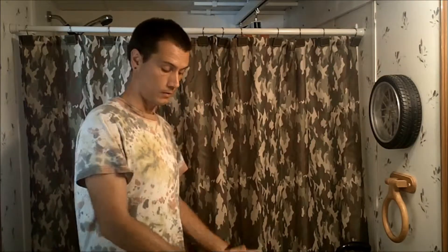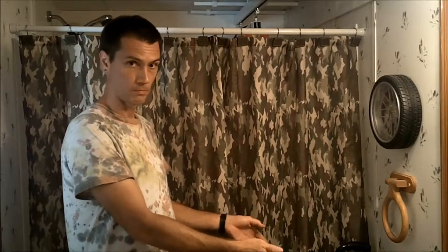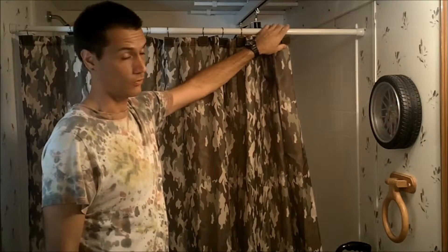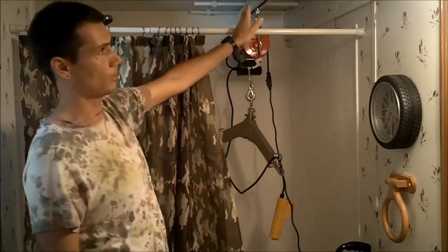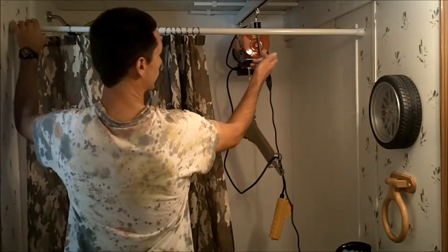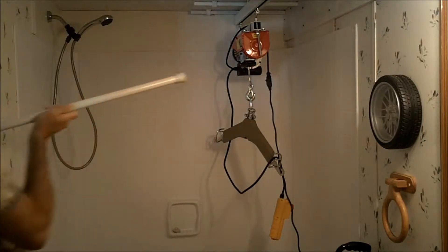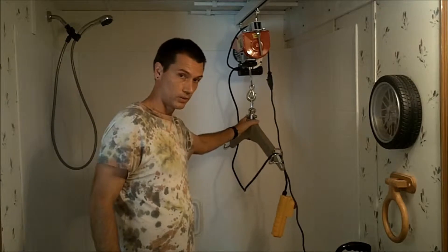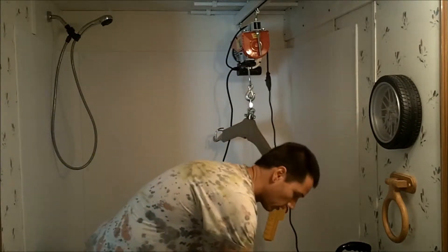For our purposes, it's easier for me to back him into the bathroom right up next to the tub. He's sitting in his manual chair, back to the wall, sitting in the sling. First thing I have to do is remove the shower curtain rod because it obviously obstructs the sliding of the hoist — but it's very simple to do.